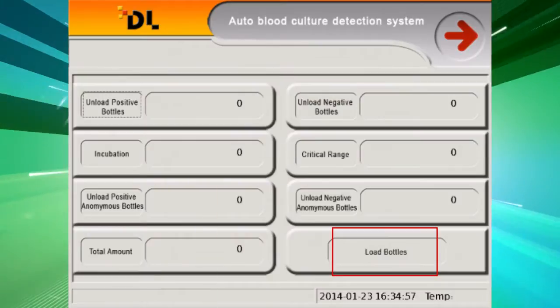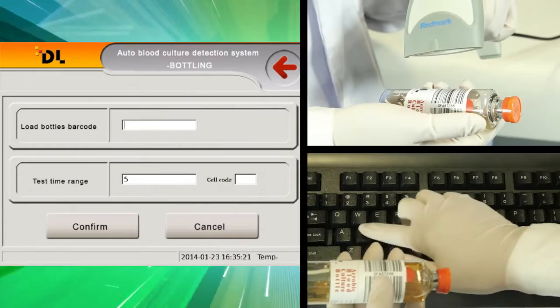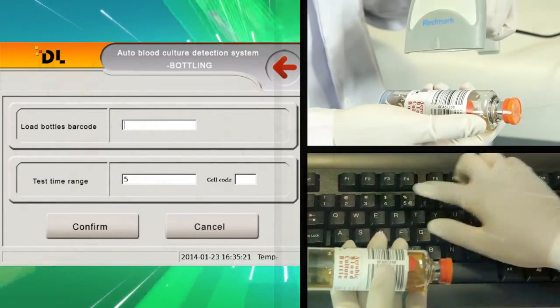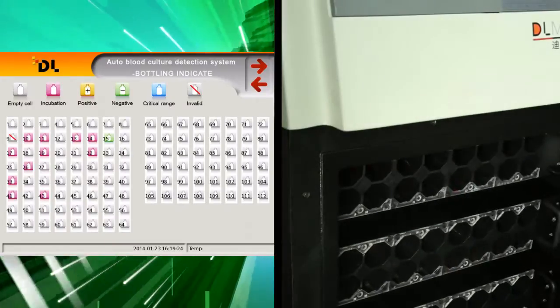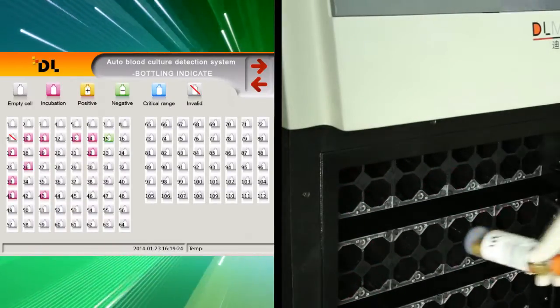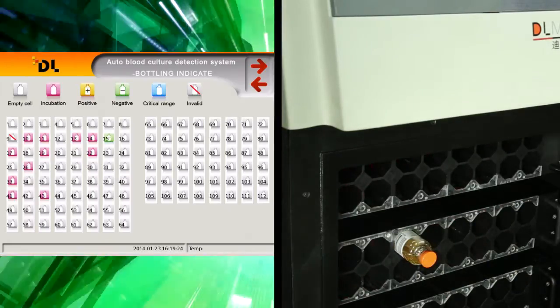Bottling procedure: Click Load Bottle and the loading interface will be shown. Scan or input the barcode manually — the test time range can be modified. Put the bottle into an available incubation unit; the cell number will be shown on the screen. Then click Confirm. Loading is finished.